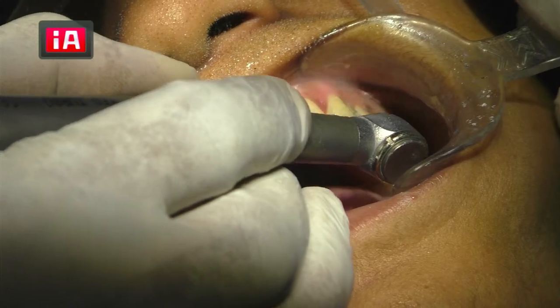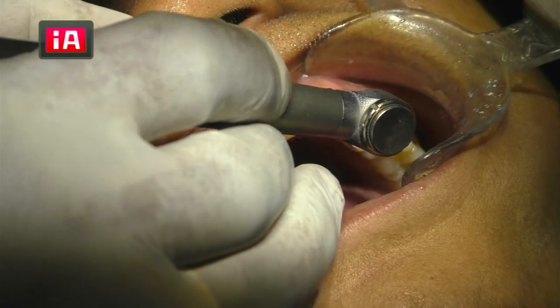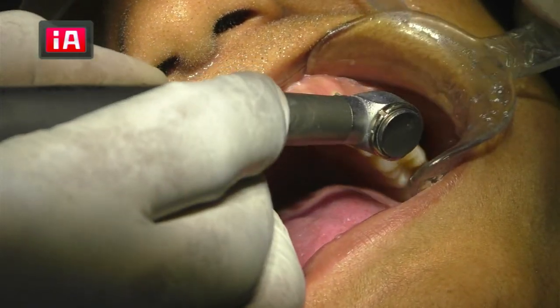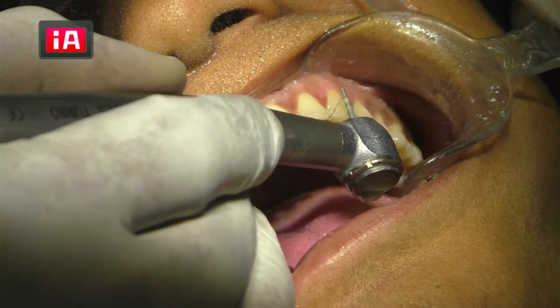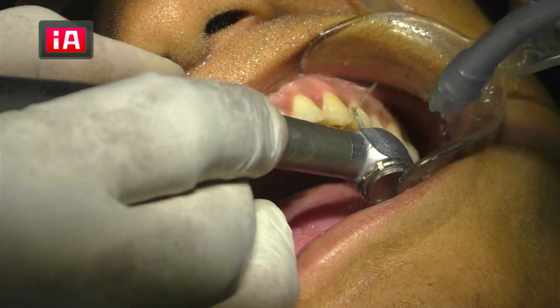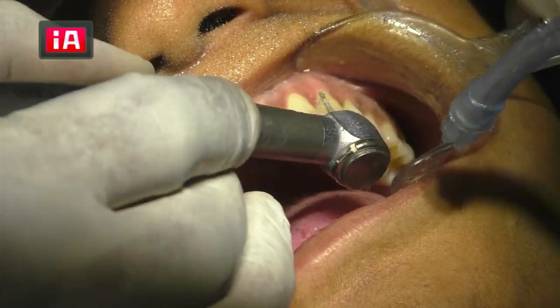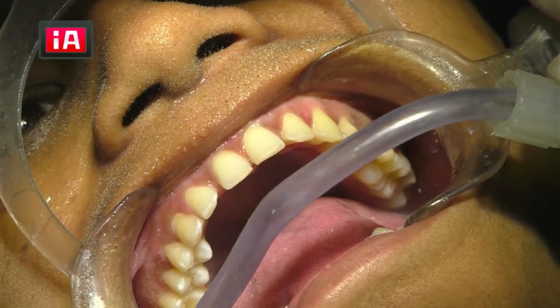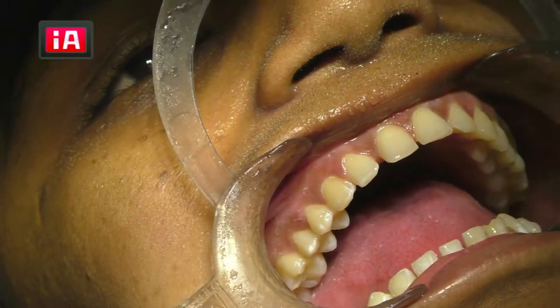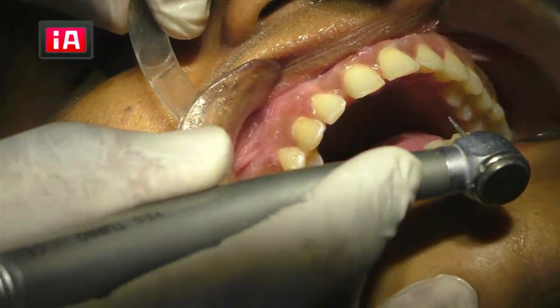Now I'll have to give a margin properly. Here again, literally I'm not going to break the contact. I'll end in the proximal side. Now the labial preparation is done. Now I'm going to do the finishing margin. I'll give a margin properly from canine to this side. Start from the canine.